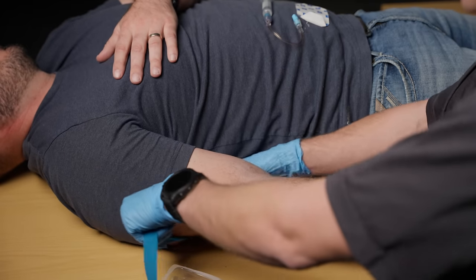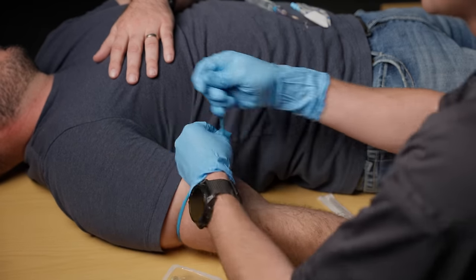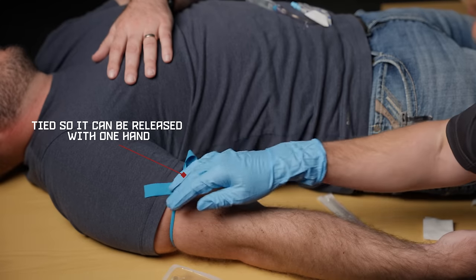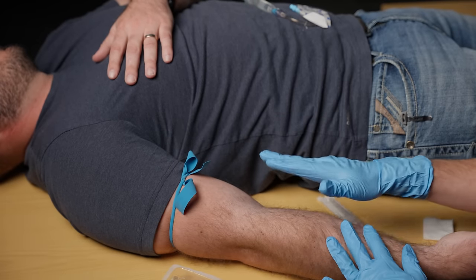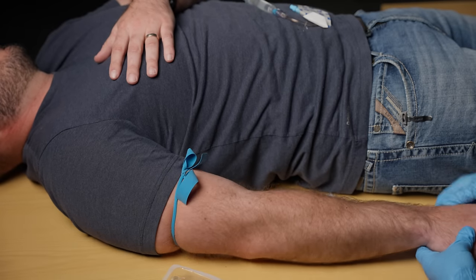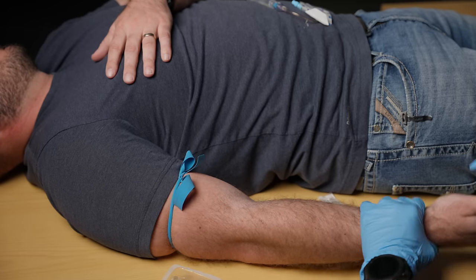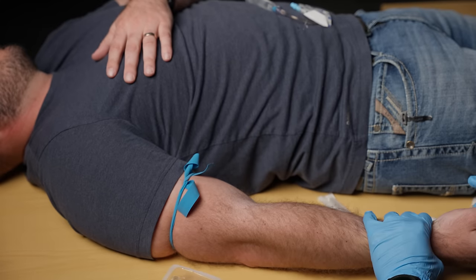I'm going to take this tourniquet and put it above the site I'm going to start. When you're starting IVs, generally speaking you want to start lower and go higher. Different floors and units have different preferences. In EMS we go for AC sites because they're more of a sure thing than smaller veins on the hands or wrists, but on a med-surg unit a lot of nurses really like the IVs lower down so that when the patient bends their arm it doesn't stop whatever medication they have going.